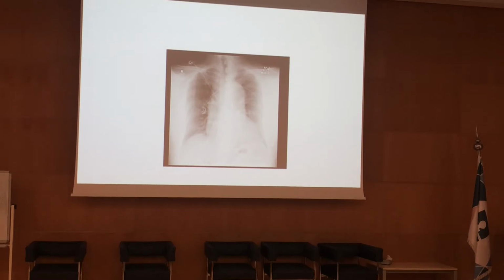No, more critical than this. Can you raise your hand if you want to answer, please? I can hear you. Excellent. So this is aortic dissection. See this from here to here.